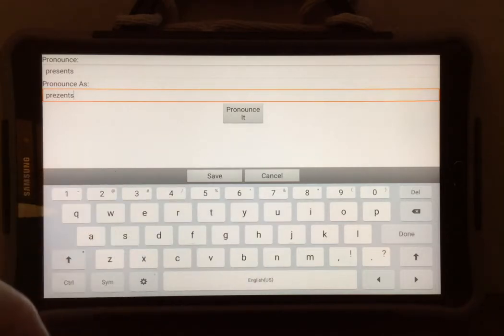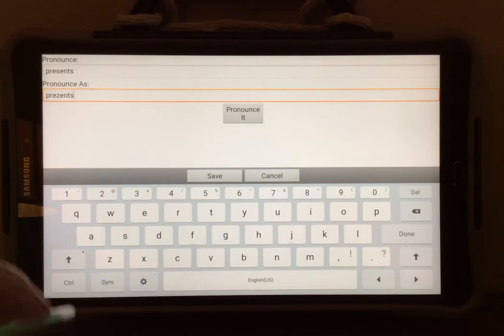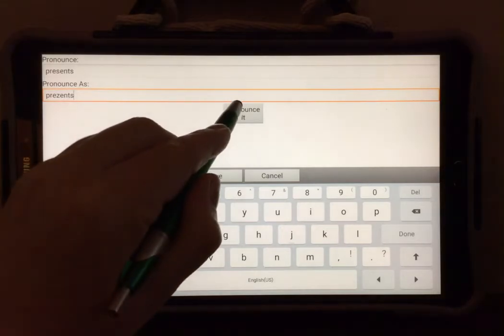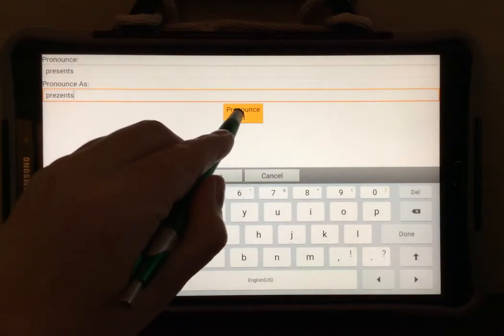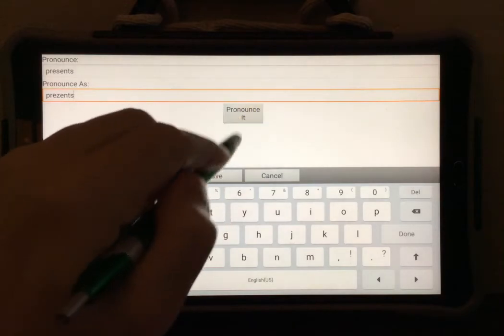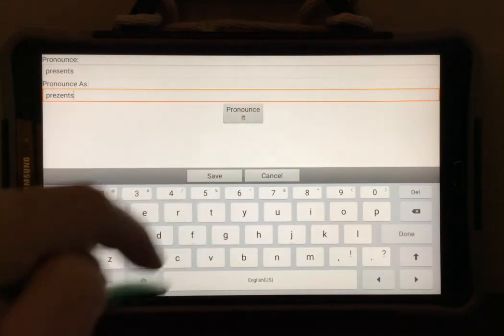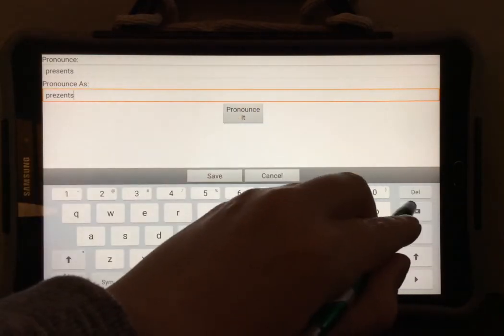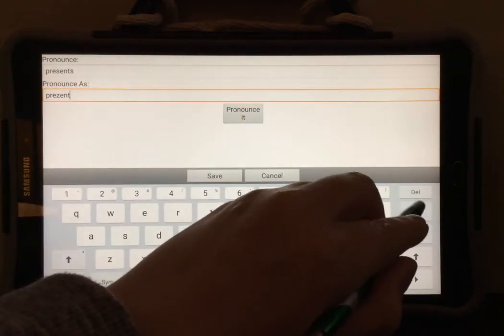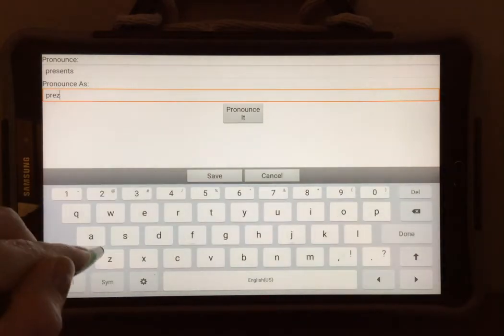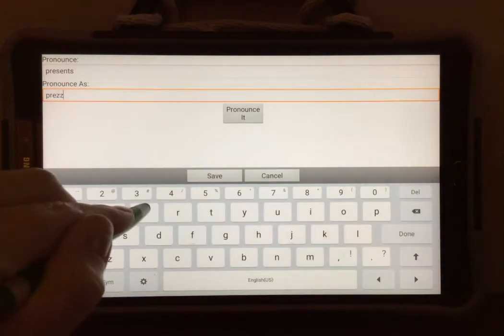You can test your word by touching pronounce it. If it still doesn't sound accurate, delete and try spelling the word a little bit differently.